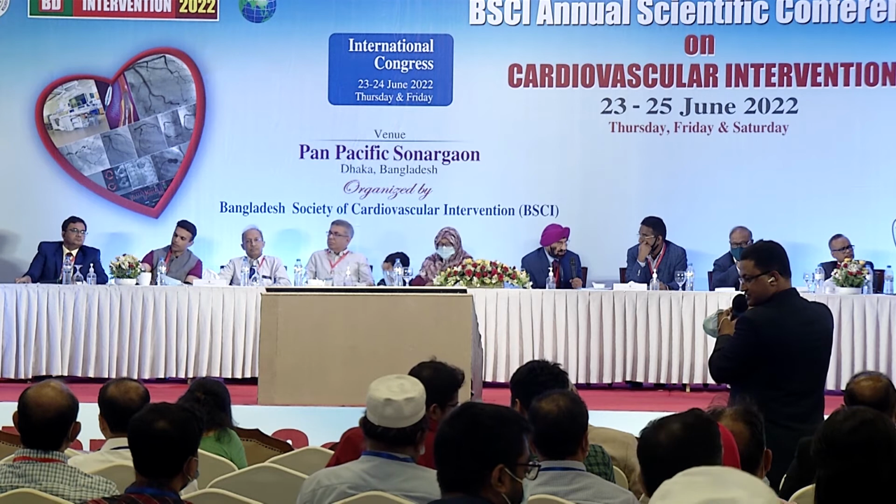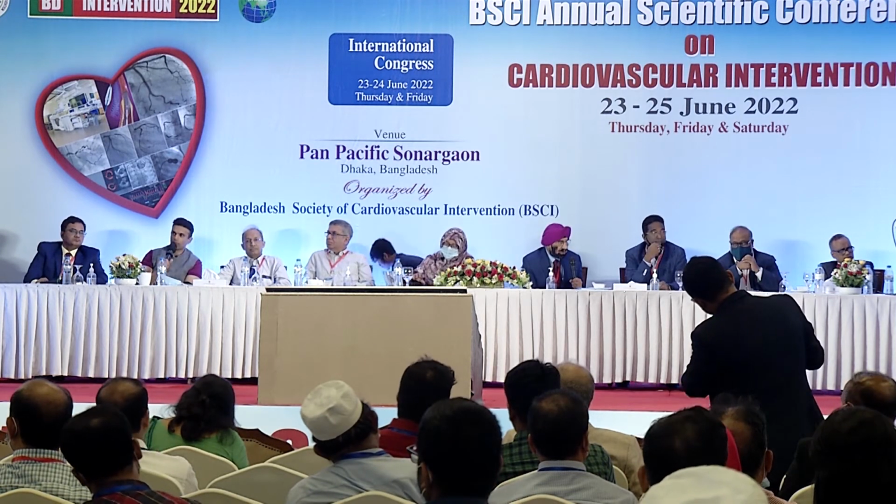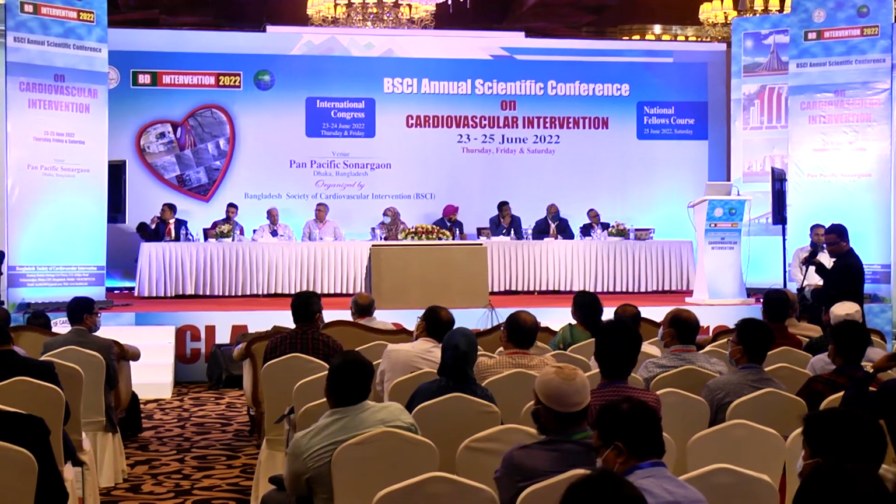I also tend to believe that since we have done a pre-PCI assessment with IVUS, it will be fair to stick to IVUS only, and edge dissection can be very well appreciated on IVUS also. That's also a valid point. OCT systematically undersizes, IVUS systematically oversizes. So if you've used IVUS at the beginning, you're going to want to compare your results with the same technology so that you can match apples to apples.